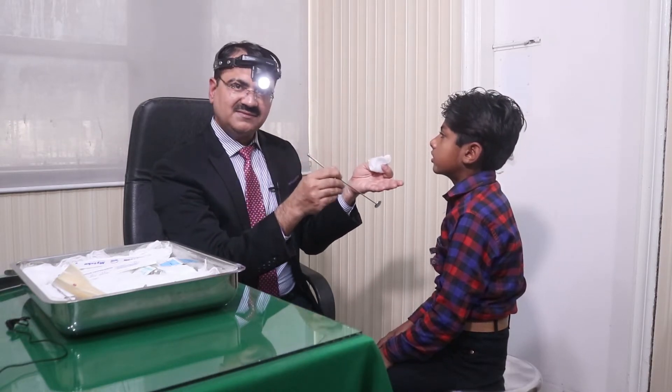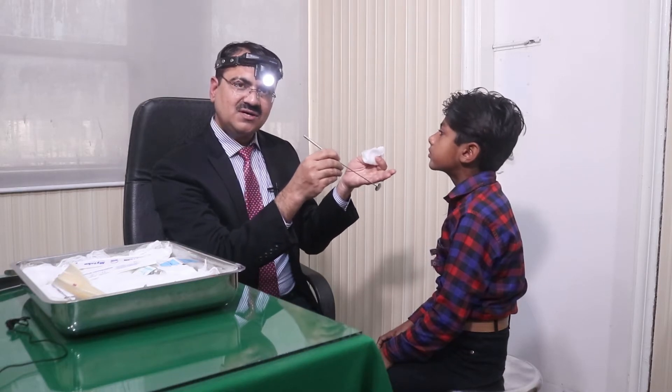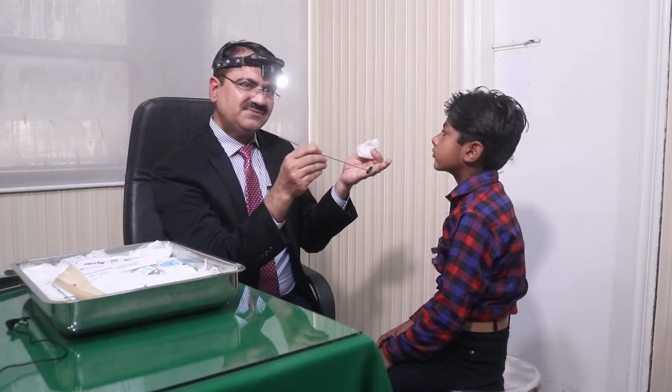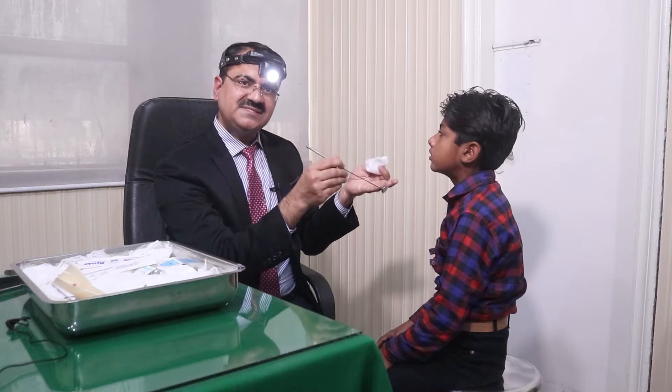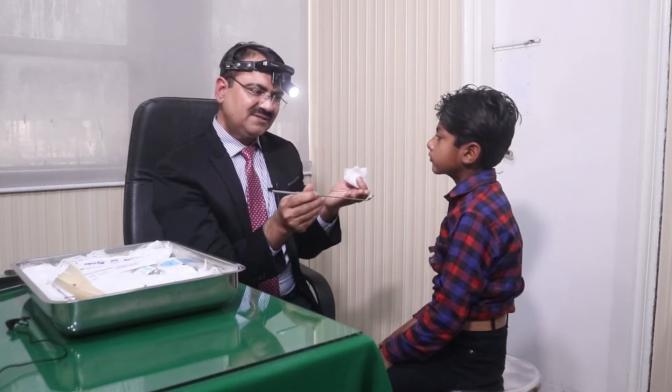As I told you: the base of tongue, the vallecular, the vocal cord, the pyriform sinus, the post-pharyngeal wall, and the post-cricoid region — you can see all of these.